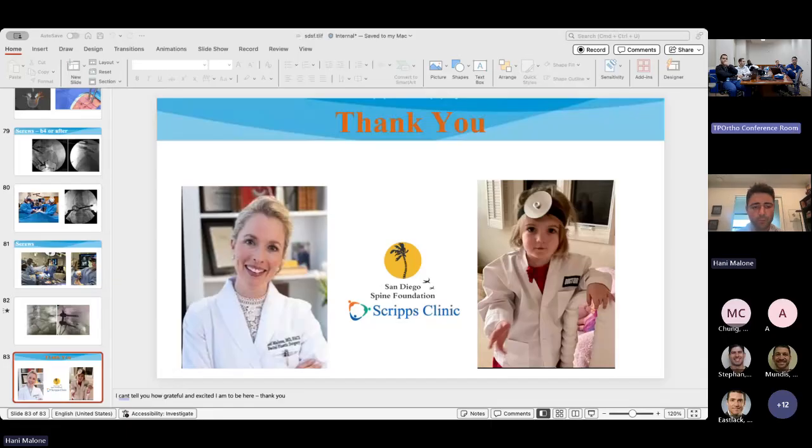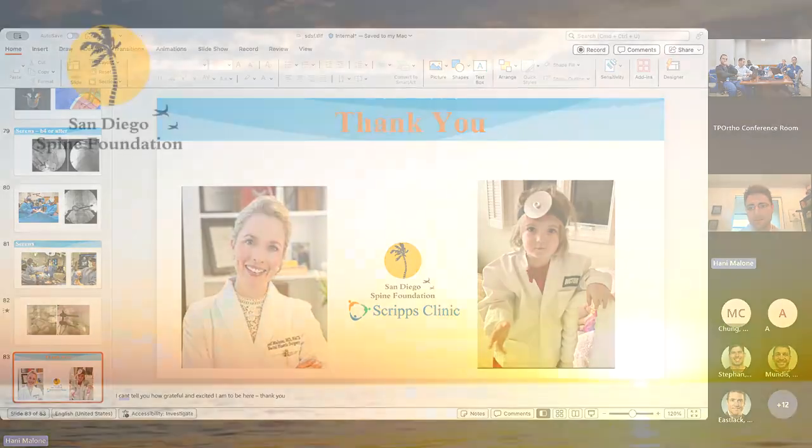Yeah, I think the prepping of the disc is also different because you're used to ALIF, where you can see all the disc you need to take out, but this one is much more of a feel, bringing it into the center of the disc where you can then extract it. I was surprised that even though I thought they found a lot of it, there was still the amount left. So I totally agree with your idea that you could do a disc prep in 10 minutes, but you're going to be leaving a ton of it behind. Right, and we've already created maybe a disadvantage by going TLIF instead of ALIF or lateral. So it's worth spending 40 minutes on the disc prep, because you want them to heal, right? So yeah.